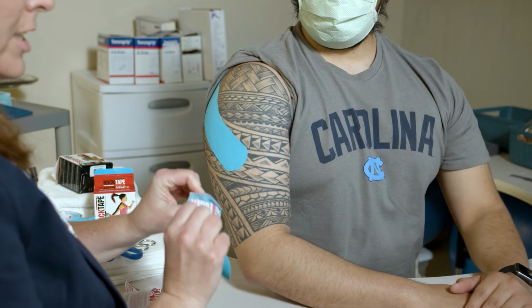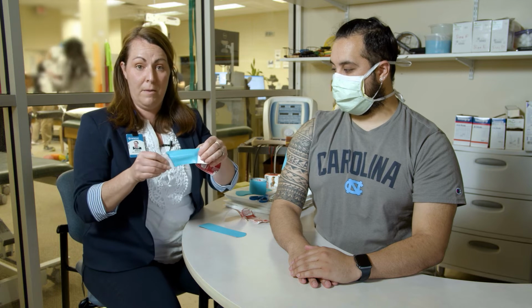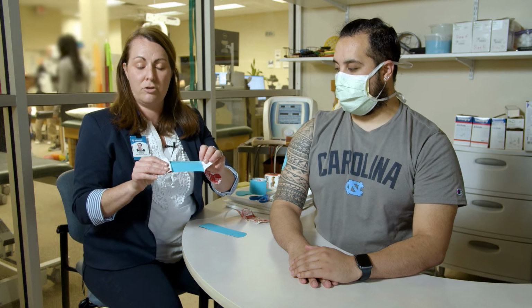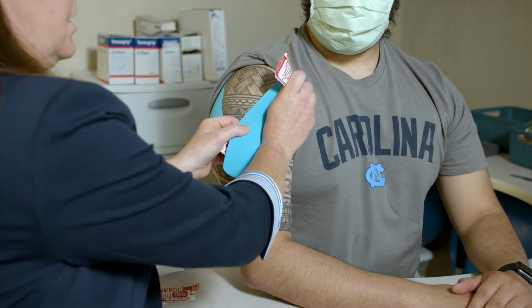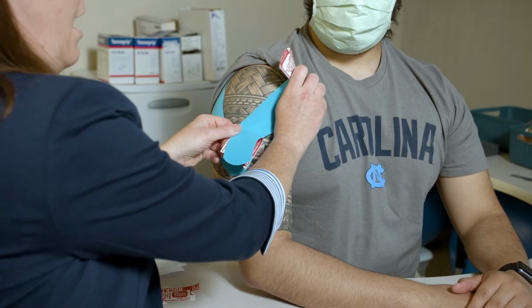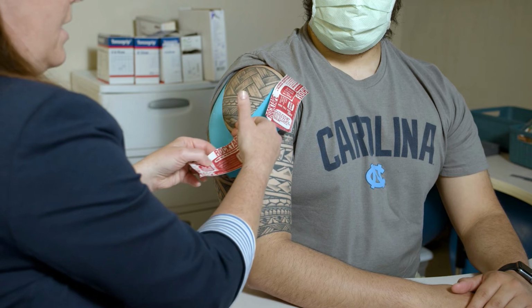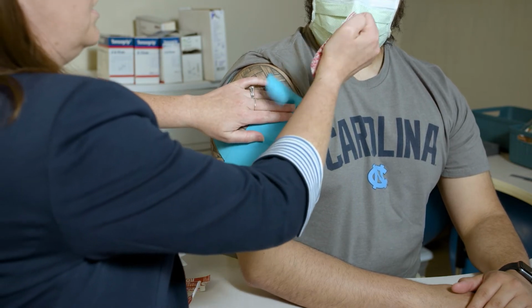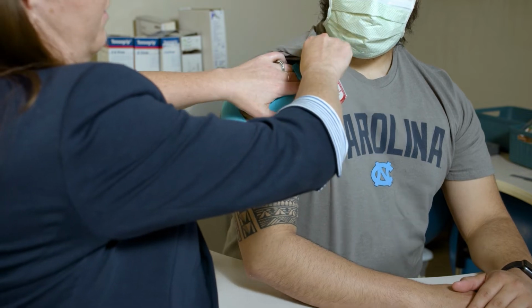This tape is pre-stretched. You might not be able to see on the camera there, but it has a wave pattern to it. And the idea is that it's stretched on the tape, and when you apply it to the skin, it's going to pull up that skin ever so slightly. And that's going to help kind of decompress those layers of tissue, help decrease pain where that layer may be.